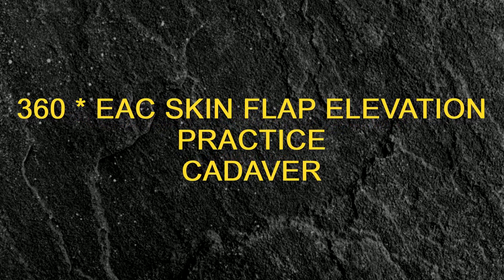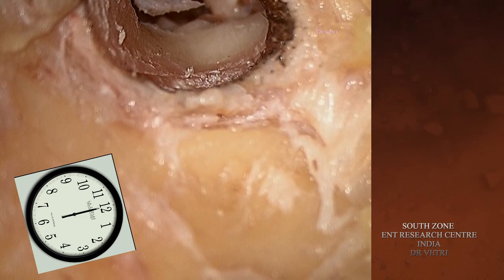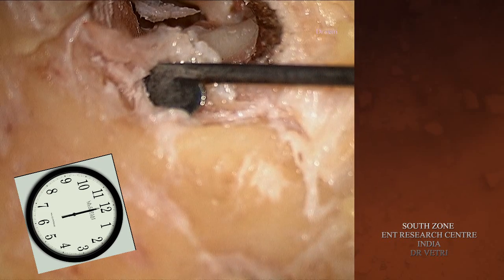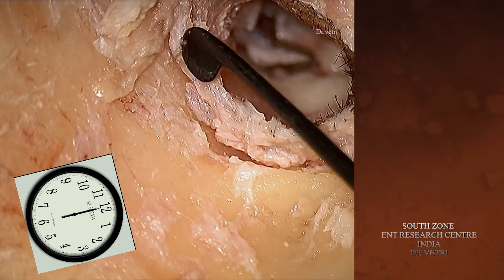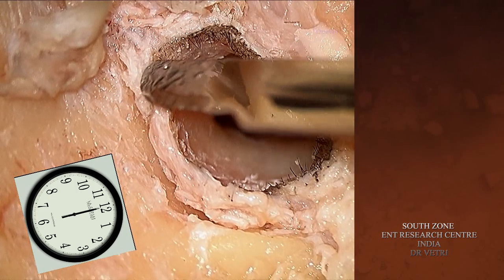External canal skin flap elevation, microscopic. This is a cadaver temporal bone. Already a grommet insertion has been done and the posterior tympanomeatal flap has been elevated. Here you can see the incisions given along the periosteum of the posterior canal wall, and now the incision given along the inferior canal wall skin.